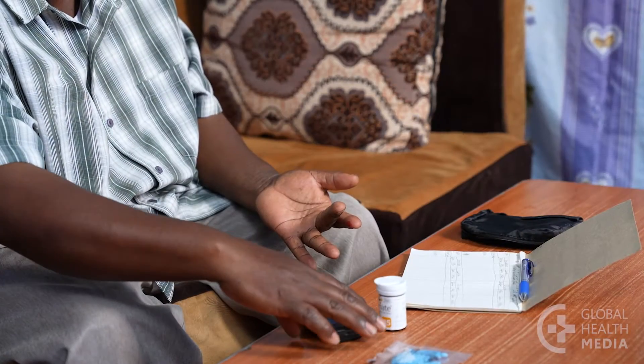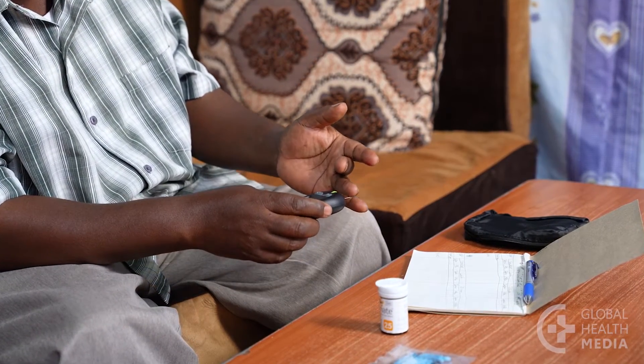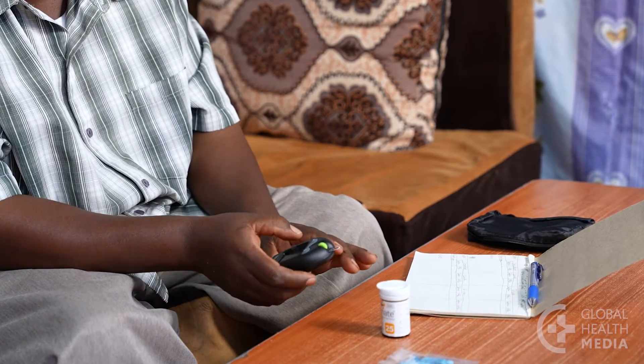Borrow or buy a blood sugar meter and a supply of strips. Use the meter to measure your blood sugar before and two hours after your largest meal. Do this every day for a week or two. Keeping a record will help you see the trends.